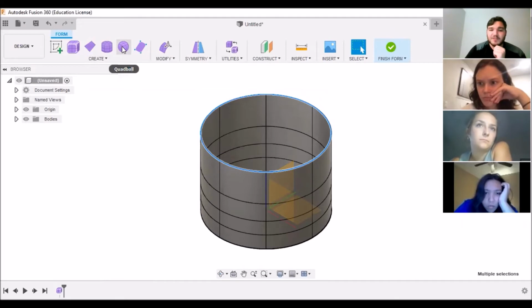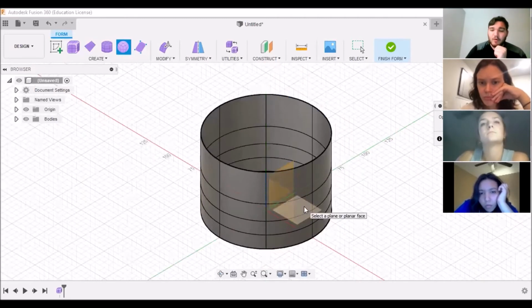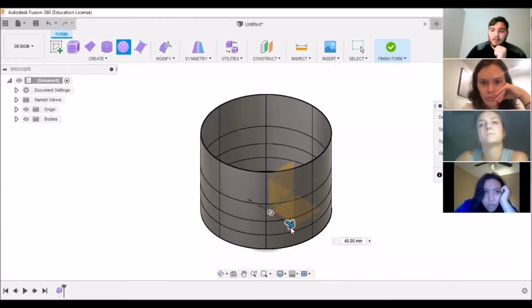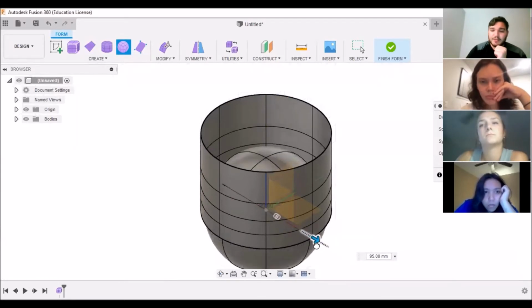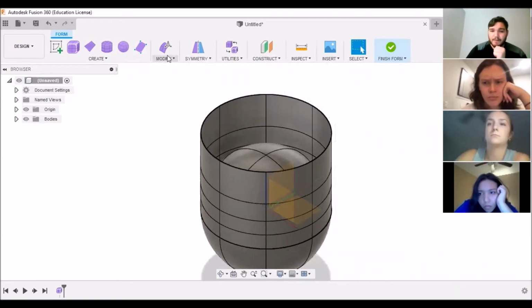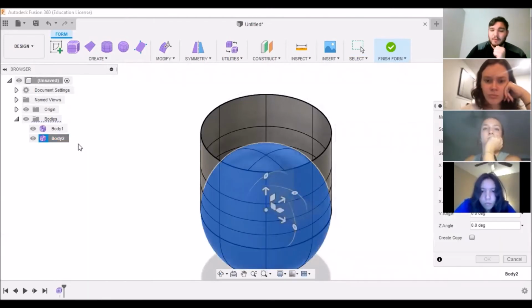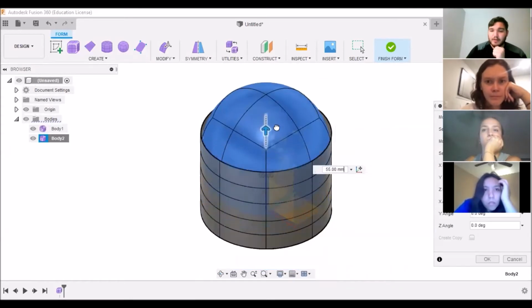Same thing, instead of a sphere, we can now make a quad ball. Now we don't have a top surface geometry anymore, so we can go back to the bottom and repeat. A quad ball of diameter 100. It'll automatically create a new body. From the body tab, we can right-click, move copy. And from there, you can move the entire body as a whole.